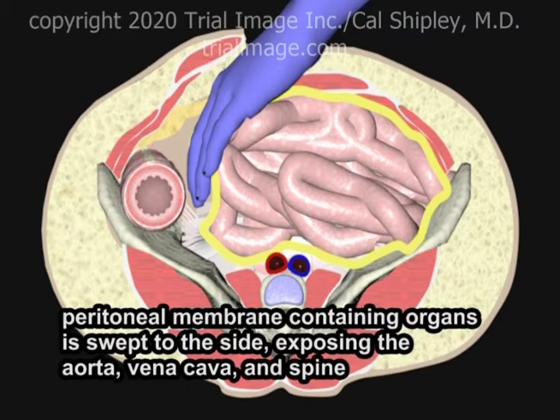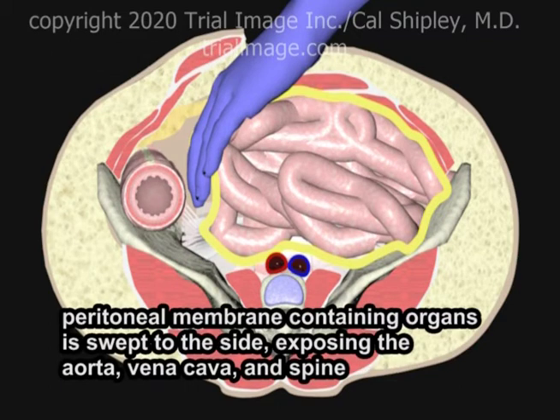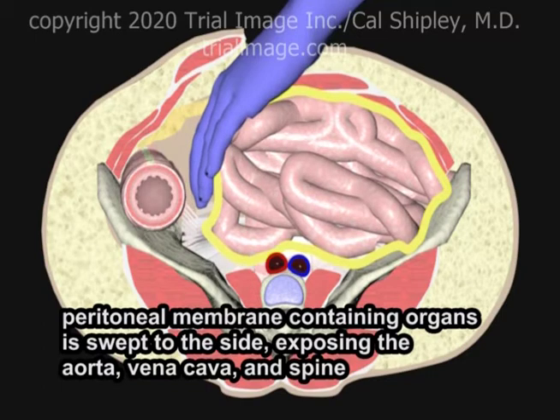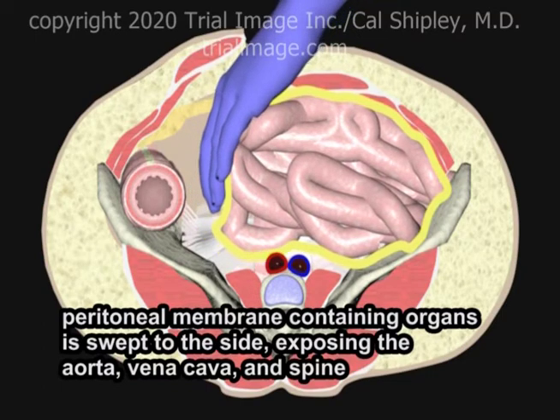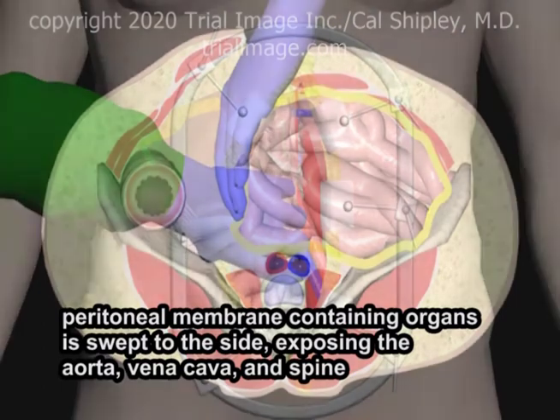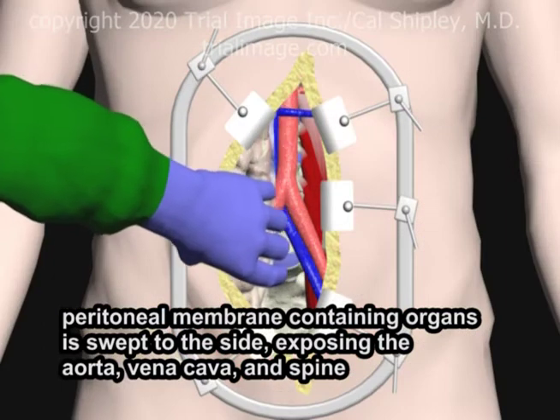The peritoneal membrane and the organs that it contains are swept to the side to expose the aorta, vena cava, and the lumbar spine.